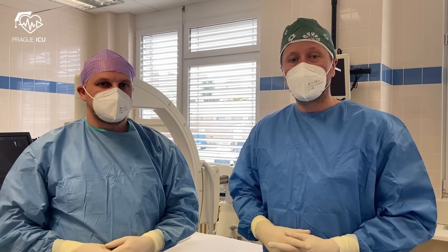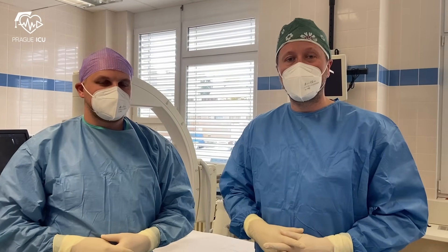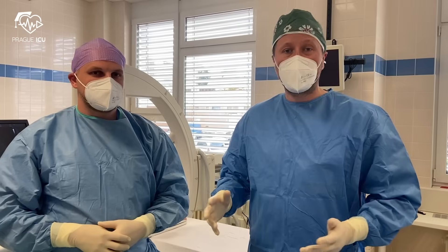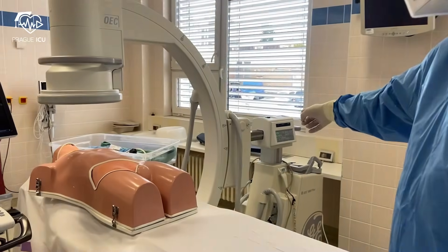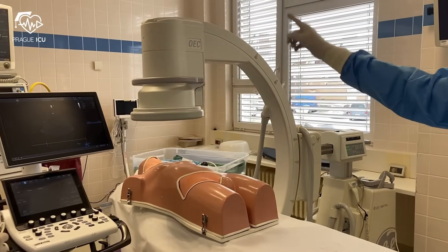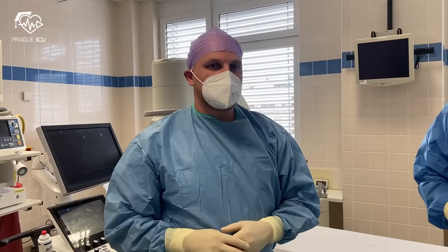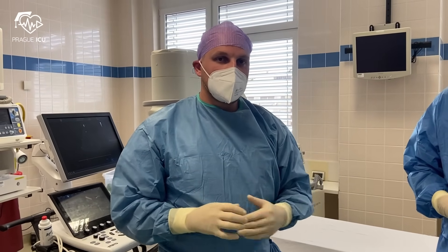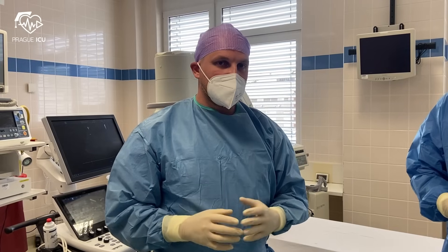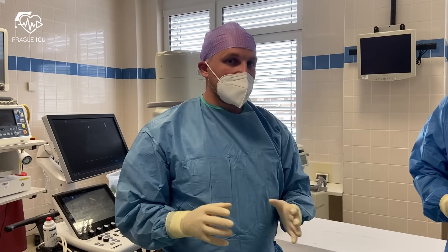Hi guys, I'm Mikhail from Praga ICU and I'm Marek. Today we're going to show you how to insert a VA ECMO. Everything is ready. It is important to understand that there is a difference between VA ECMO insertion in patients with cardiogenic shock and during ECPR. Both procedures have their own specificities which we are going to show you.